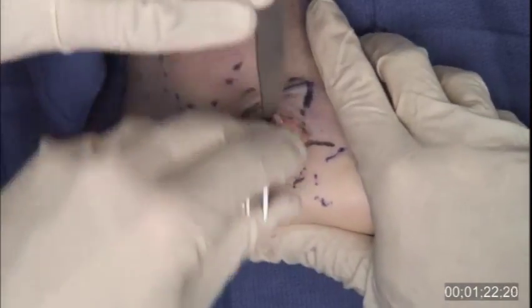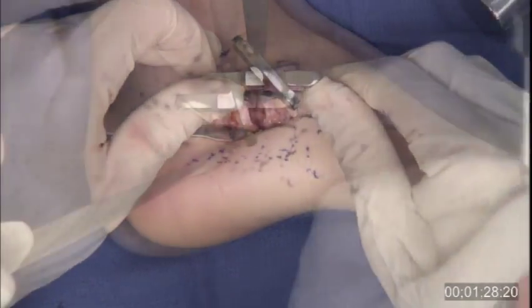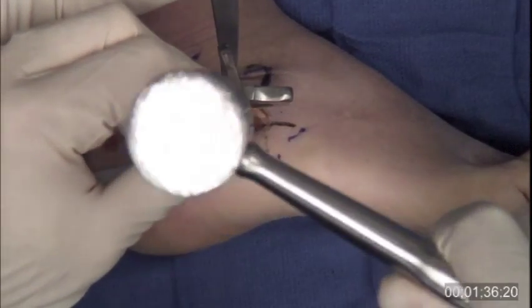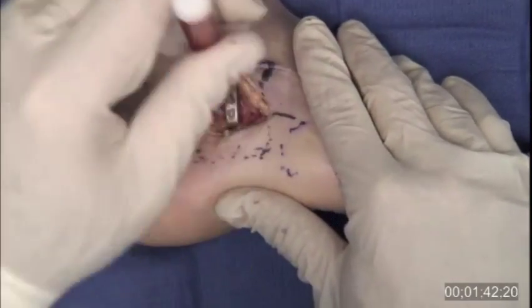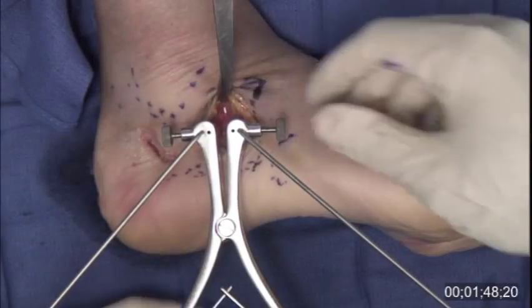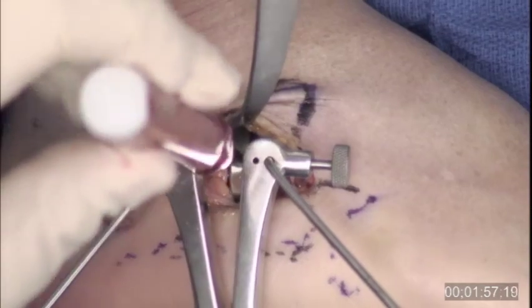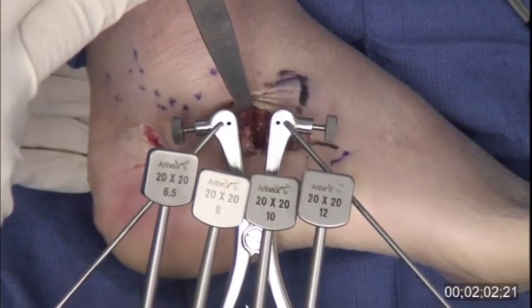The osteotomy can be opened with a lamina spreader or pin distractor. The appropriate amount of distraction is confirmed clinically and radiographically, and trials are used to select the appropriate size BioSync Evans wedge. The wedge should completely fill the osteotomy without protruding beyond the cortex of the calcaneus. The thumb screws of the Arthrex pin distractor prevent migration of the distractor with tension. Integrity of the medial cortex at the osteotomy site can be confirmed by direct visualization. Multiple wedge sizes are available to ensure a proper fit.